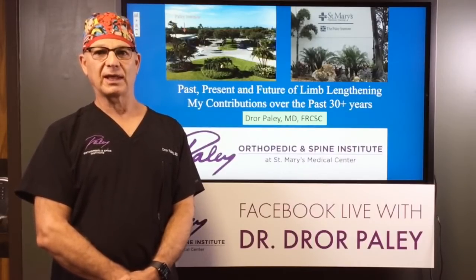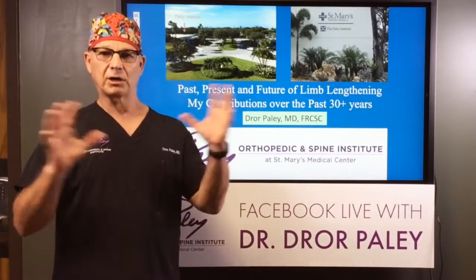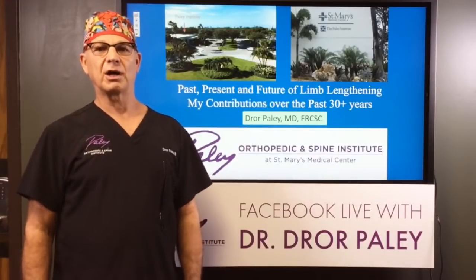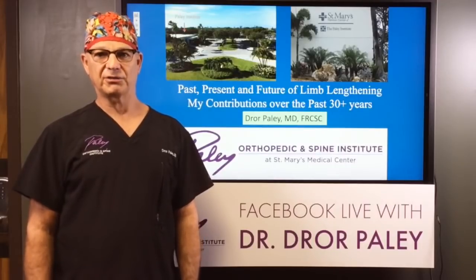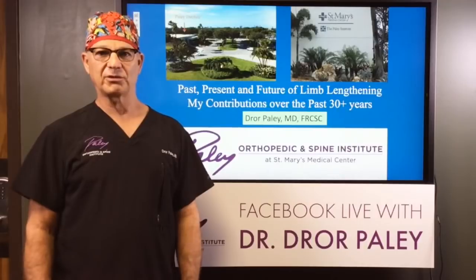But before we get to that, and before we get to talking about his device, let's look at the entire picture. And the entire picture is that limb lengthening started off with devices called external fixators. And these are devices that bolt on the outside to the leg. And let me show you the history of these devices.